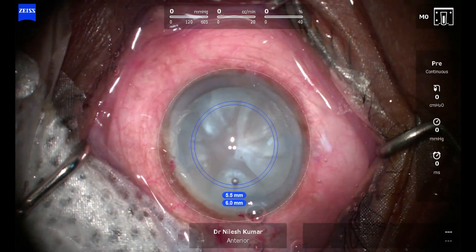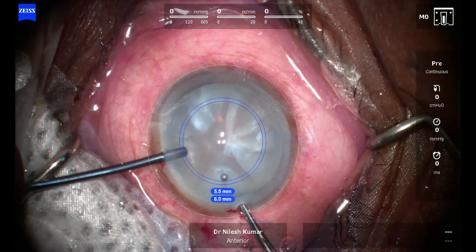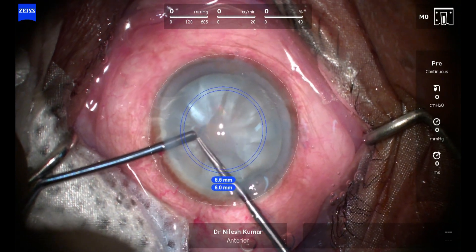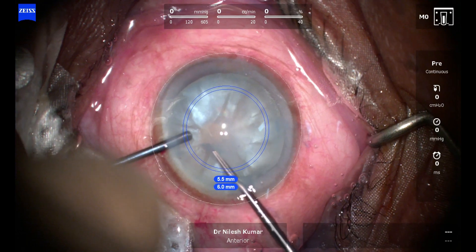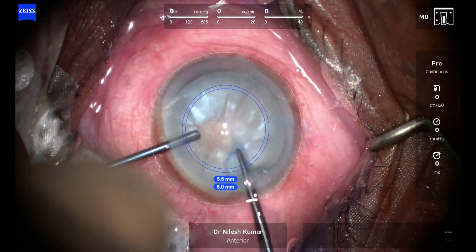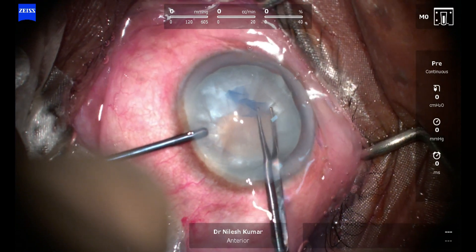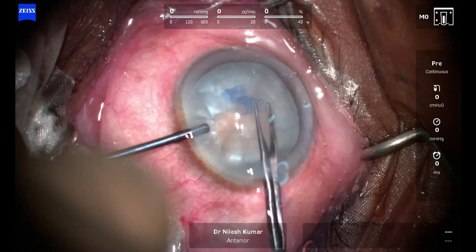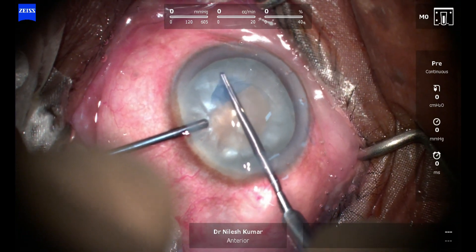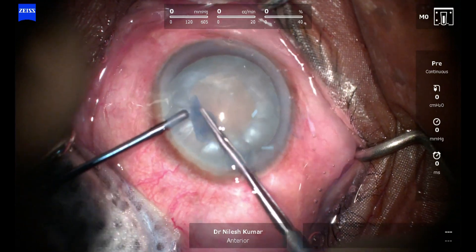Now again we start with capsulorrhexis, puncture the central capsule, and you can see there is an ooze of fluid — that fluid came out, so you can be sure it was going to run off if this had not been done. This rhexis was a little smaller than anticipated; at the end it was around 5mm, a little less than ideal, as it was a brown nucleus speaking from behind.